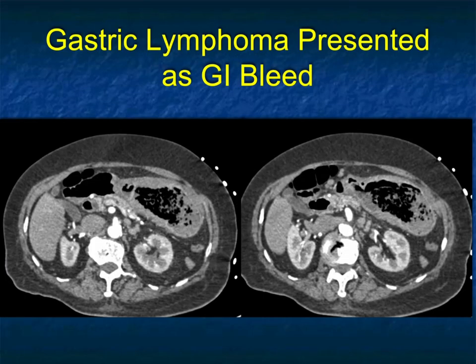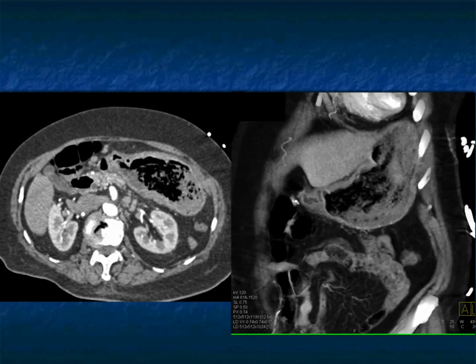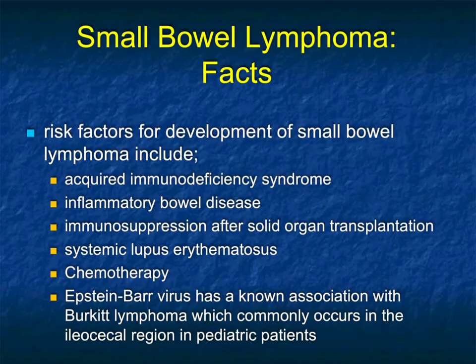Another example: a patient with GI bleed. In the fundus and body, the stomach is markedly thickened compared to the antrum, with some antral involvement and mottled material in the stomach — this was also gastric lymphoma, nicely shown on the coronal view as well.